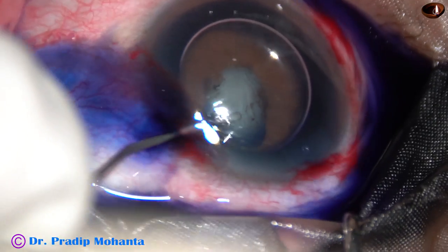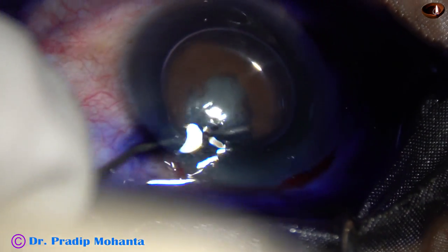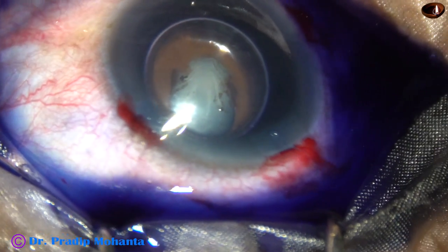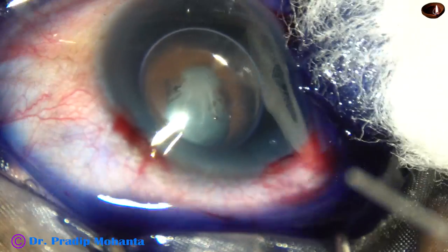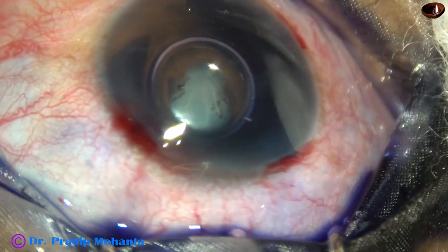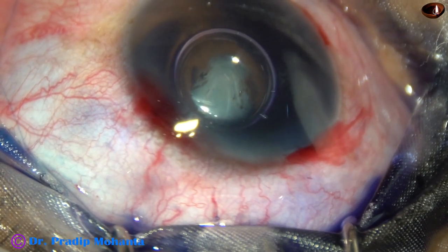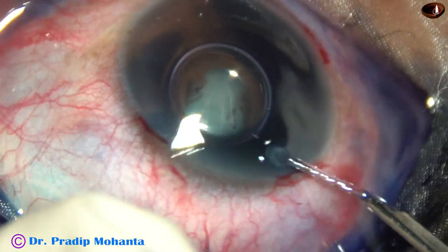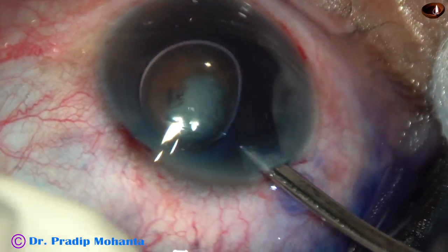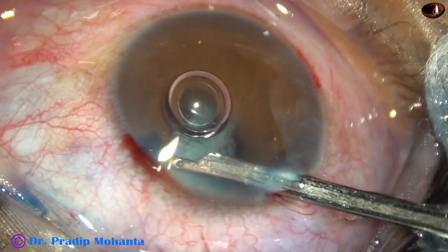Now I go through the left side port and inject some dye behind the iris on the right side. The capsule will be stained uniformly in the peripheral part where I will do the rhexis. Otherwise the dye will stain only the central part. Now I wash the dye out with the 23G Simcoe.